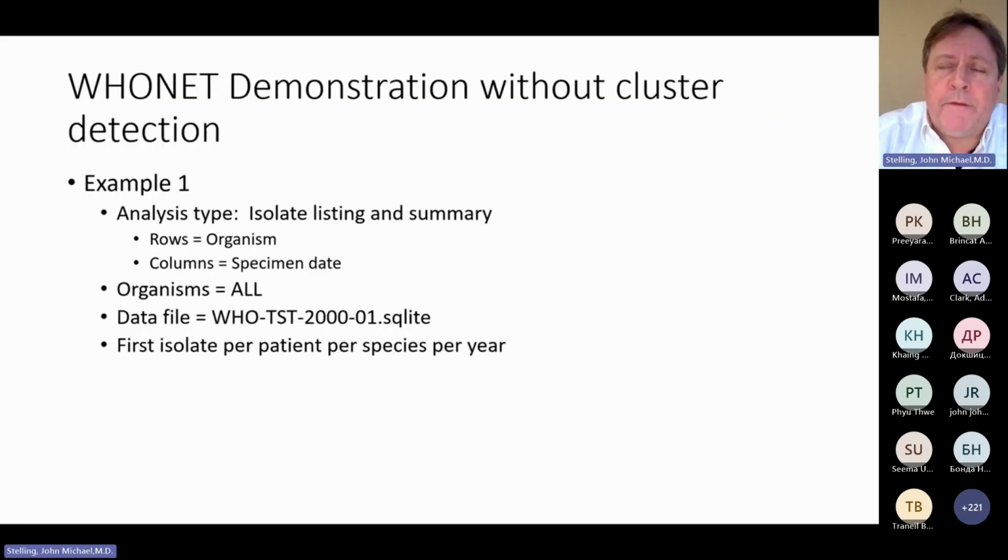That was the first example of manual outbreak detection, where you simply look at the graphs. But that's a lot of graphs to look at, many organisms, many rooms. So yes, you can do manual outbreak detection. And I do know hospitals that do this monthly. They look at the results once a month, and they have noticed outbreaks. So this is not a bad method. Many hospitals have found value in manual review on a monthly basis.